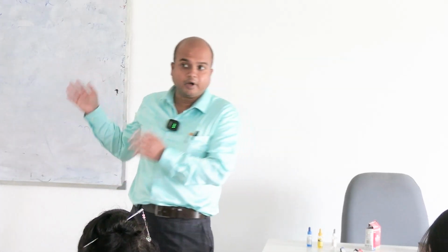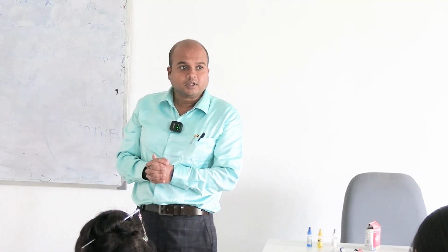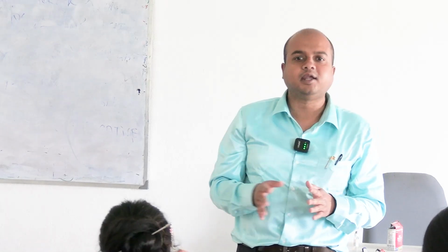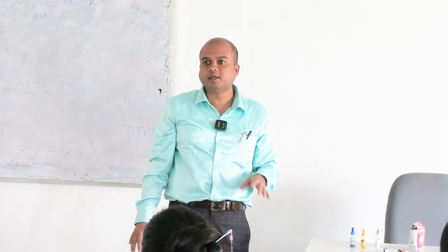This agglutination reaction may occur naturally in the human body. What Landsteiner's law says is that alpha can't be present if A is present, and beta can't be present if B is present. If the corresponding agglutinogen (antigen) and agglutinin (antibody) come together, then an agglutination reaction occurs. So if A and alpha come together in the same individual, there is an agglutination reaction inside the body. Here we are making the agglutination happen so that we can determine the blood group.